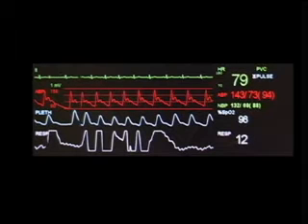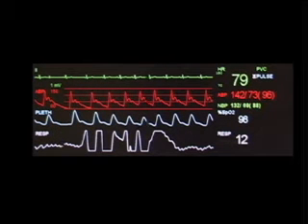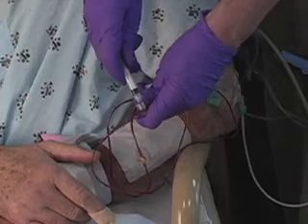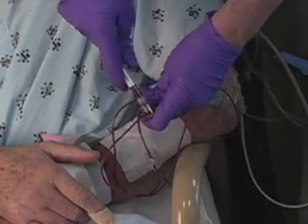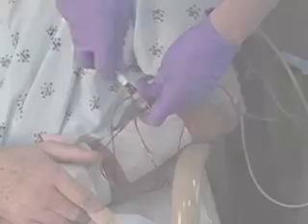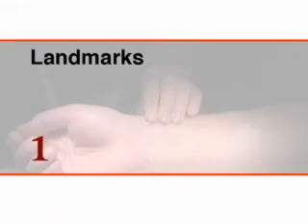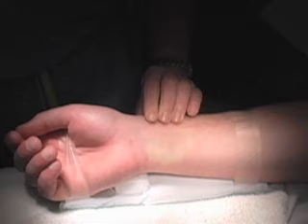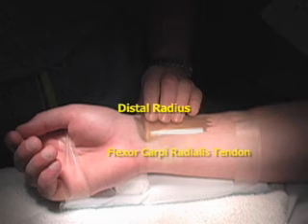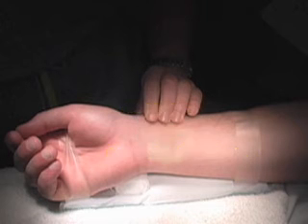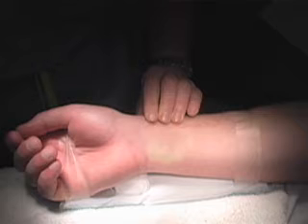Placement of an arterial line is indicated for continuous monitoring of arterial pressure and direct arterial blood sampling. The radial pulse is palpated between the distal radius and the flexor carpi radialis tendon. Prior to line placement, perfusion of the extremity should be checked.